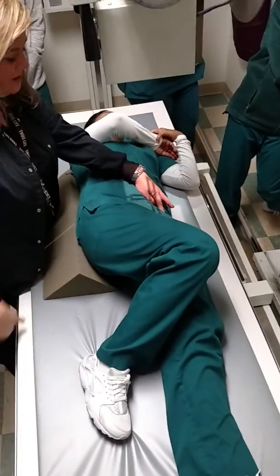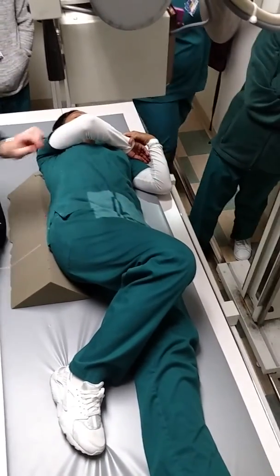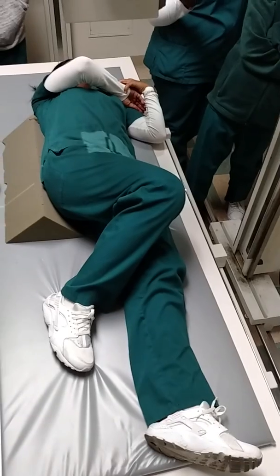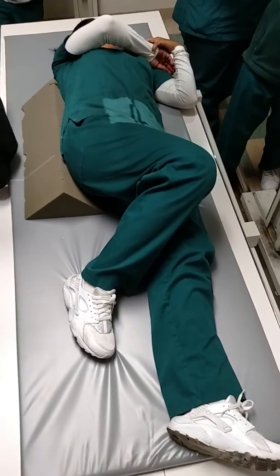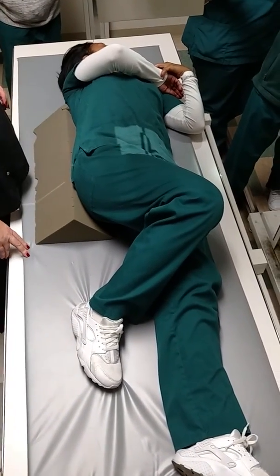And since we're on the down side, we're going to get down. So I'm going to go 2 down and 2 in. And I would have to use a left marker over there because that's her left side. Does that make any sense? So you're going to pull out of the thing. It's going to say, if you're doing this, left anterior brim for acetabulum. You're going to do this one.